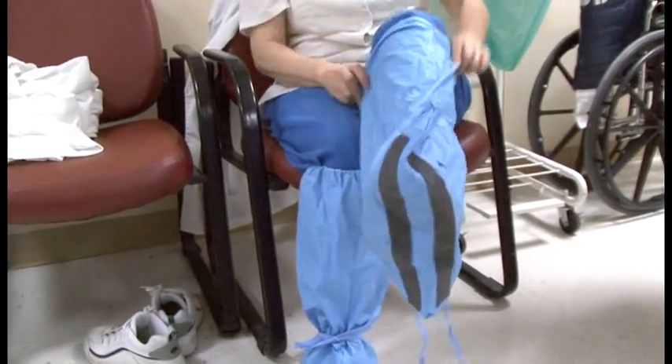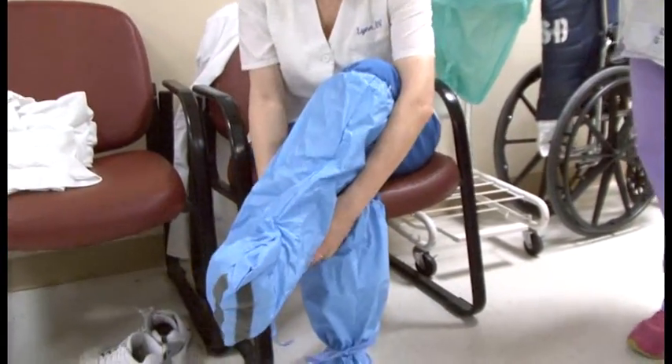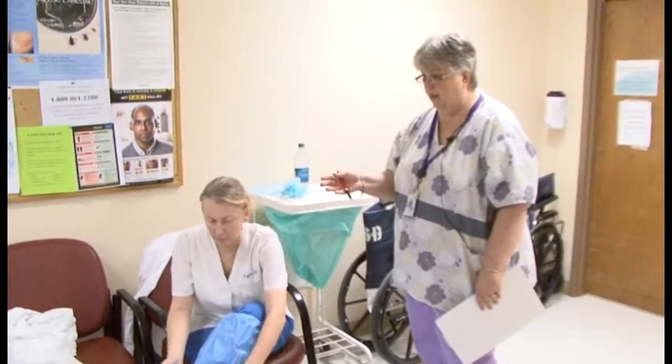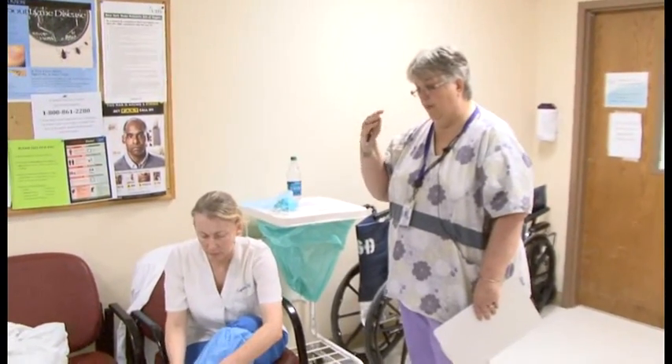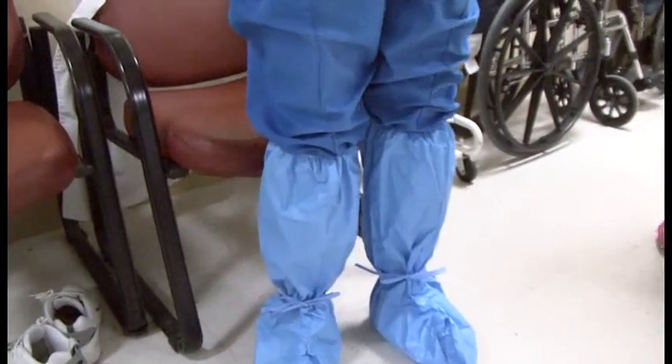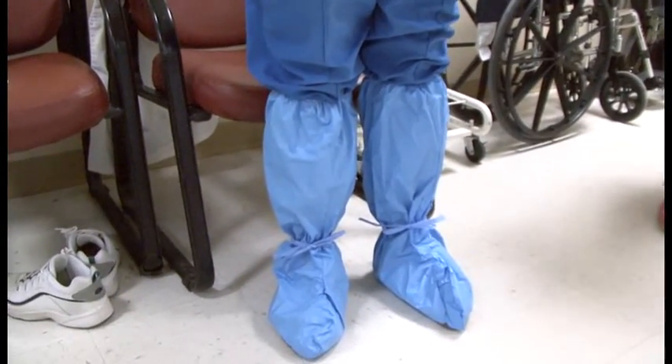Communication is extremely important between the observer and the person donning and doffing. There has to be good communication, and the observer must maintain direct eye contact with the person donning at all times.